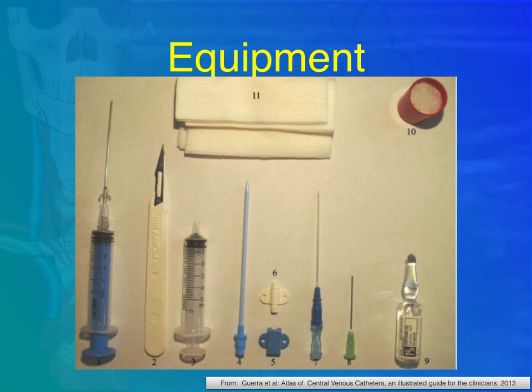These are other parts of the kit. One is the main needle or trocar that you will use to explore and cannulate the vein, and the wire will fit inside the needle. There is a scalpel that is used to puncture the skin only in order to pass a dilator. 4, you see the dilator, and this is to dilate the skin only and not the vessel. Avoid placing the dilator through the vessel.